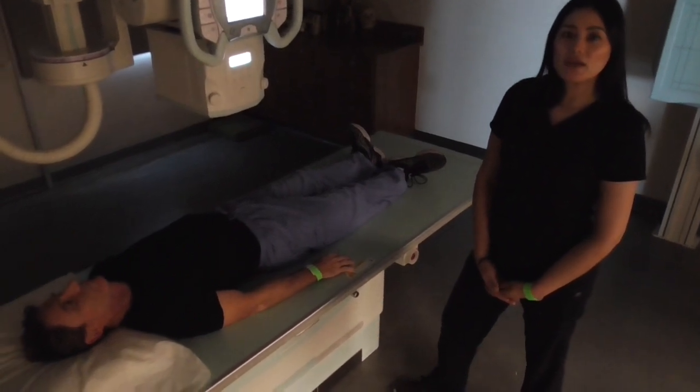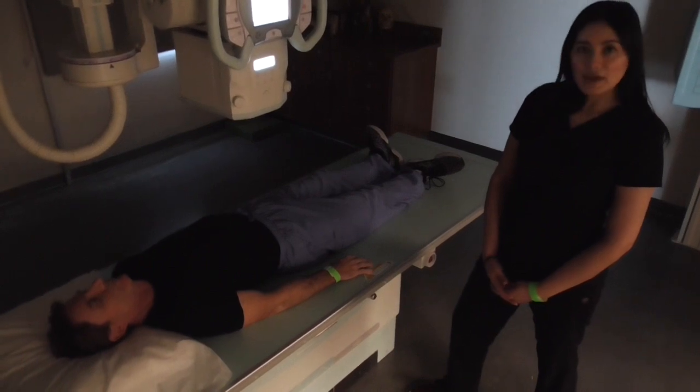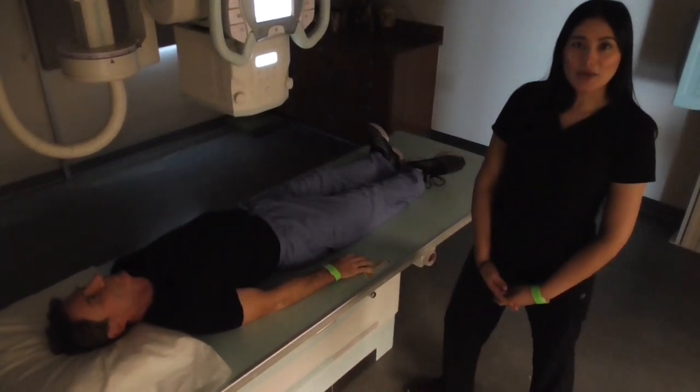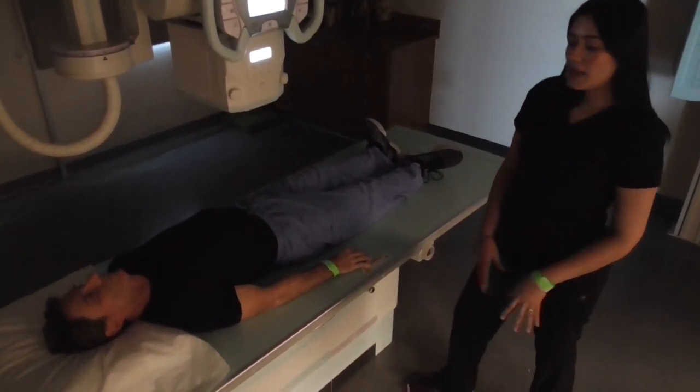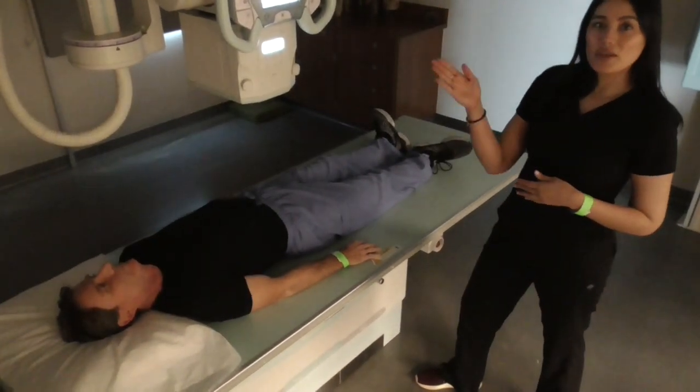We will now be demonstrating a lateral abdomen. In this case, we are going to do a right lateral. We're going to be using a 14 by 17 lengthwise. Our SID is at 40 inches.